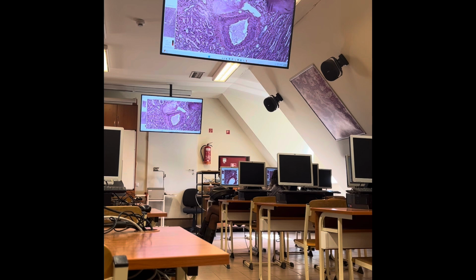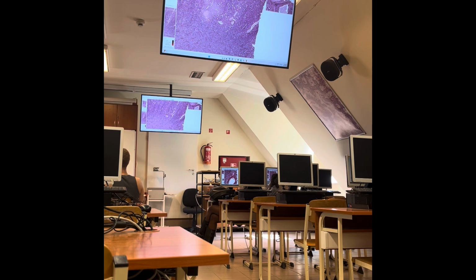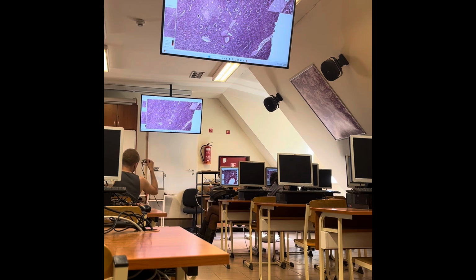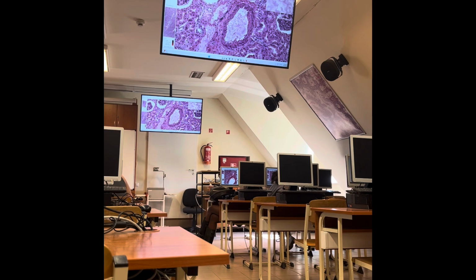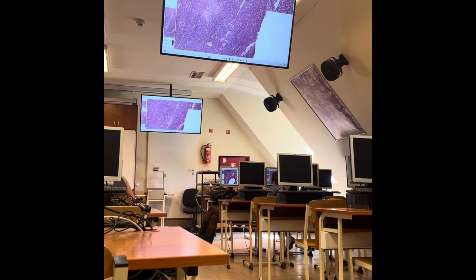Again, we find an artery and a vein next to each other, so these are the arcuate artery and the arcuate vein here. For the supply of the cortex, we find as the next segment the interlobular arteries. I cannot show you these arteries so obviously because they are not in the sectioning plane, but an interlobular vein is visible here in the section. And from time to time you can see also the artery which runs more or less parallel with it. So the interlobular artery will be the next.